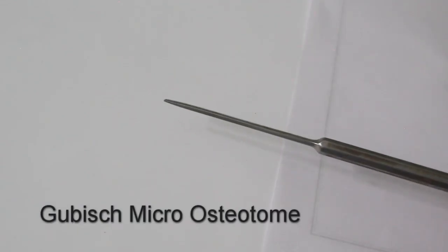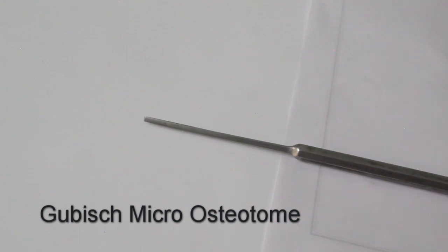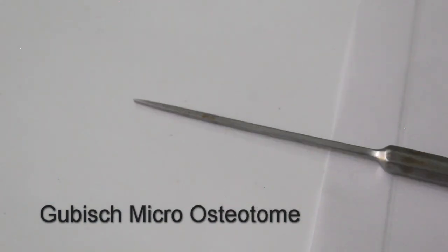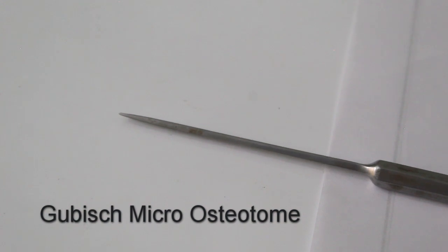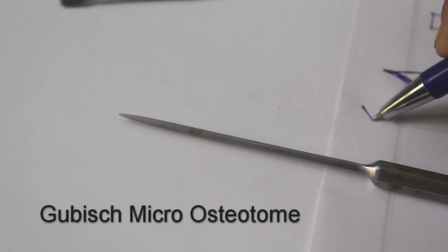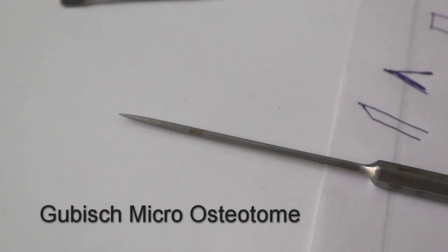This is an osteotome — specifically a 3mm micro osteotome. Residents often confuse this with a chisel. For an osteotome, the end is beveled on both sides — both sides will be pointed. Looking at it from the side view, both edges are symmetrically angled.